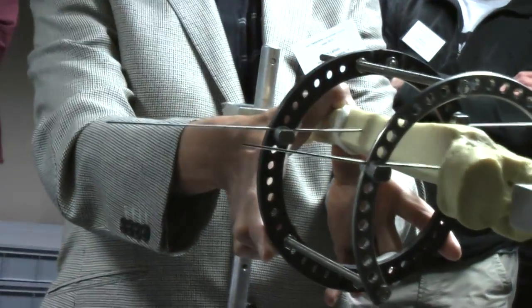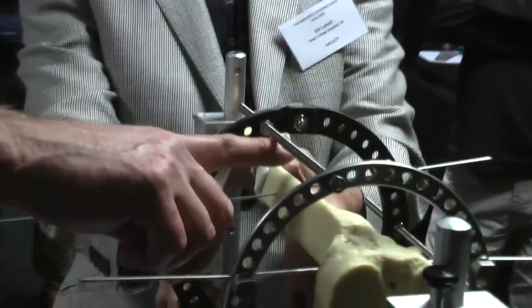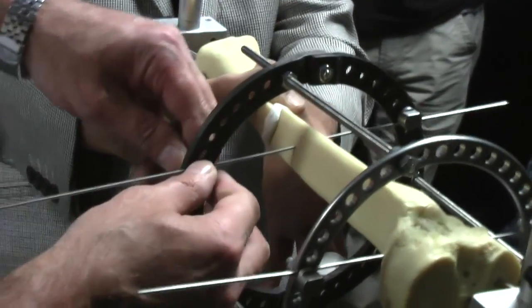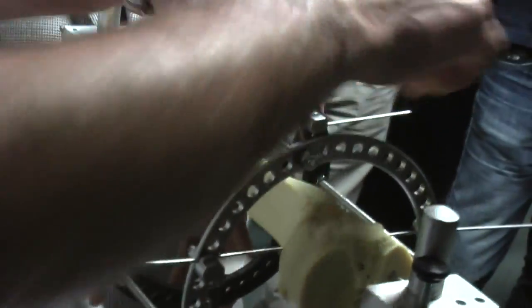Okay. Now, before we tension this second wire then, seriously, where is this bar in relationship to the tibia? It's just slightly anterior, so you need to just drop it a bit. There, that's fine. Yeah. That's fine.